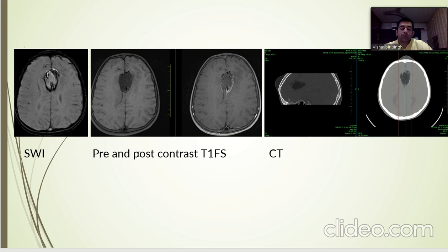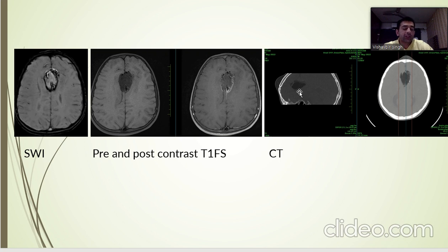The same lesion on SWI shows peripheral signal dropout. On pre- and post-contrast there is no enhancement, and on CT imaging we see that the lesion is hypodense corresponding to the low CT attenuation value of fat.